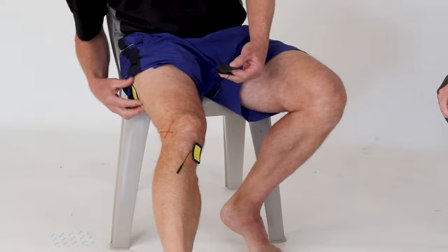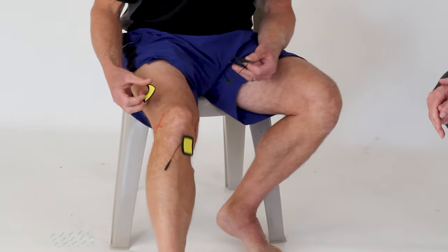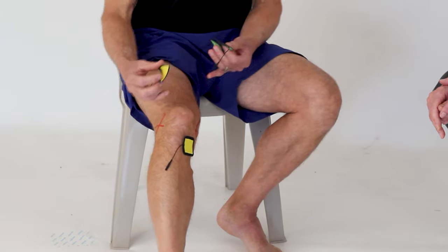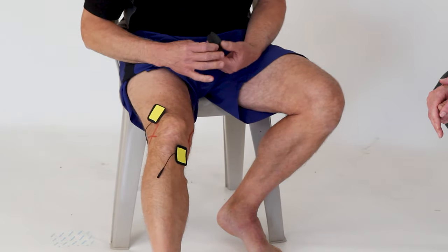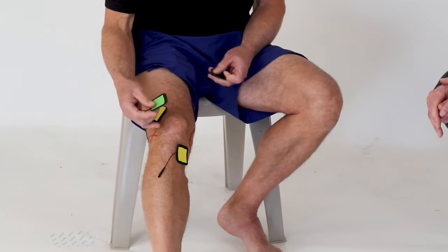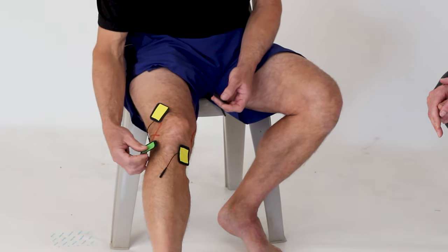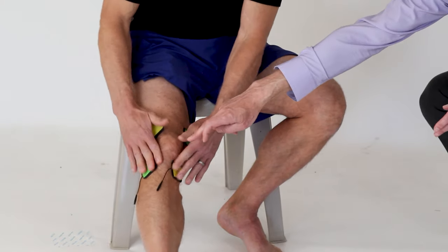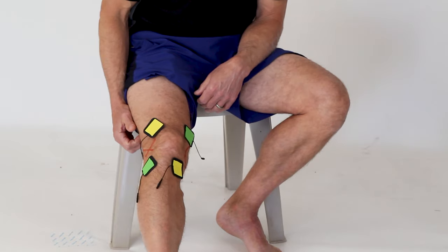So where's the pain? Let's say it's right on the kneecap. We're on the front of the knee, kind of global there. This is where the pain seems more spread out, and you want to get a bigger area covered, like the whole knee is hurting to some extent. I've done this with total knee replacements, because typically it's kind of the whole knee that does hurt. So you see how it forms an X there. These two cross and these two cross and it forms an X.